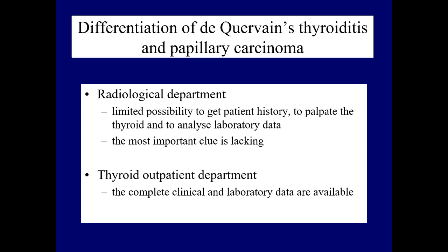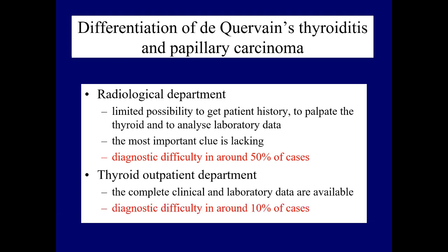On the other hand, a thyroidologist is aware of the patient history, palpates the thyroid and has the possibility to analyze laboratory tests. Therefore, an unequivocal sonographic differentiation is not possible in around 50% of cases, while less than 10% of cases may cause serious differential diagnostic problems for an experienced thyroidologist.